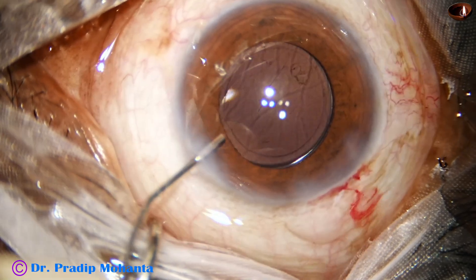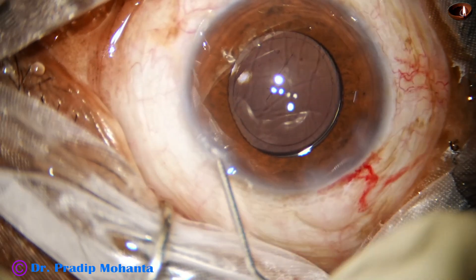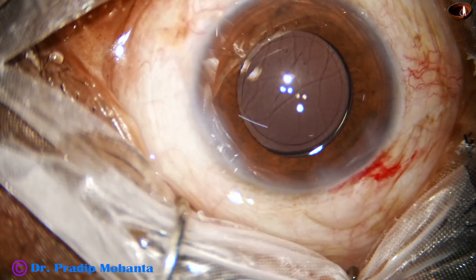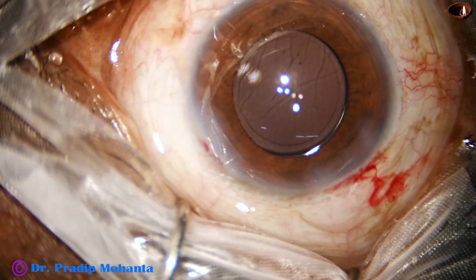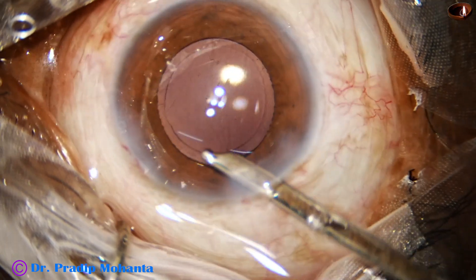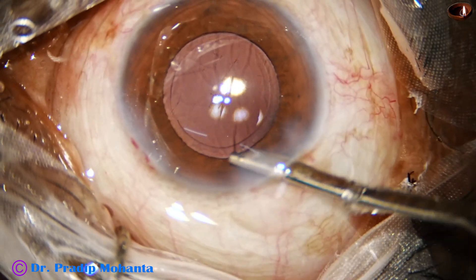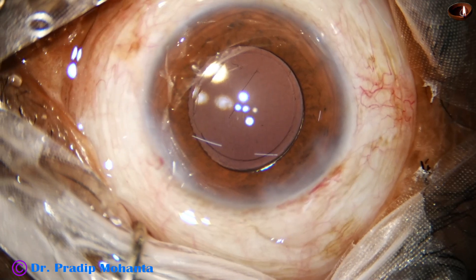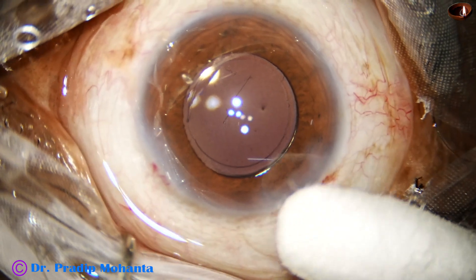This is a bit of moxie. The side port is hydrated. The anterior chamber is formed nicely with the help of this 23G Simco cannula. Any particles remaining in the anterior chamber are aspirated. The anterior chamber is nicely formed and the case is concluded.